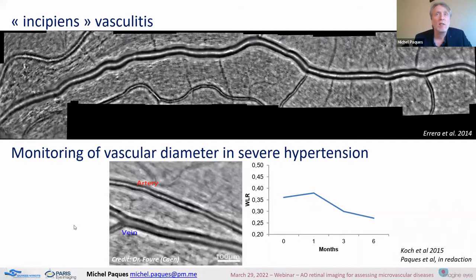So this enabled specialists of inflammation of the eye to expand their knowledge about what occurs in the eye during various diseases. And this can also provide important biomarkers for studying the effect of therapy, for instance. There are many therapies of multiple sclerosis currently, and this can help to not only detect the eligible patients, but also follow the effect of treatment, because this is reversible. But that's the first example.